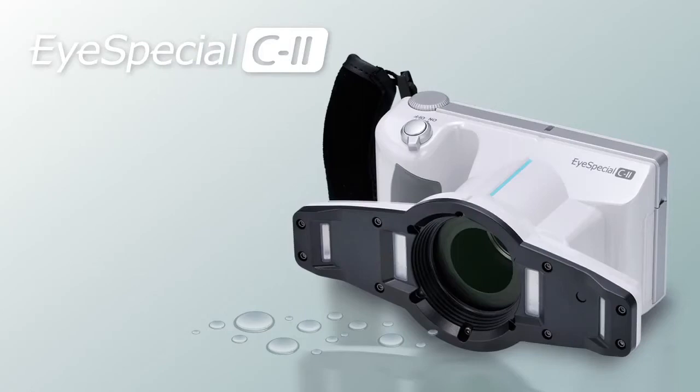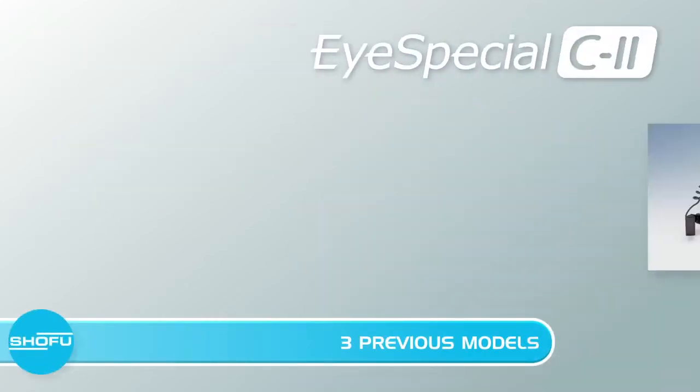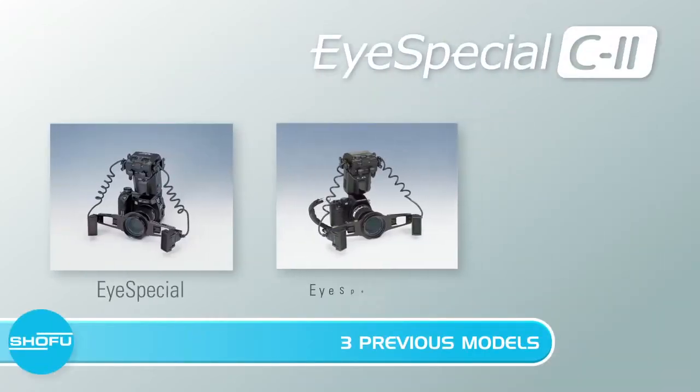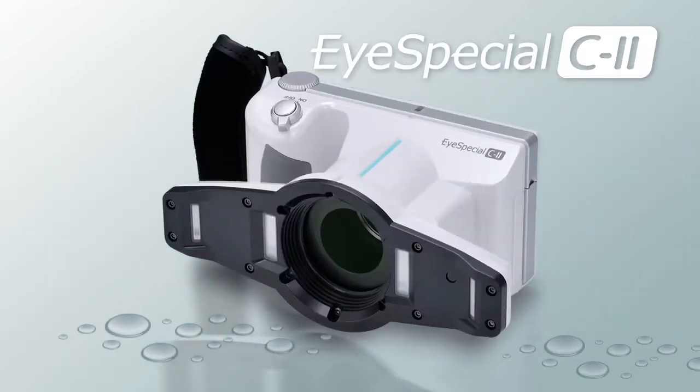The iSpecial C2 from Shofu — the smart digital camera designed exclusively for dentistry. Previously only sold in Japan, the iSpecial C2 is the fourth generation of the iSpecial family. For over 10 years, Shofu Japan has sold the iSpecial camera and been in constant pursuit of improvement to enhance dental photography, thus the creation of the iSpecial C2.